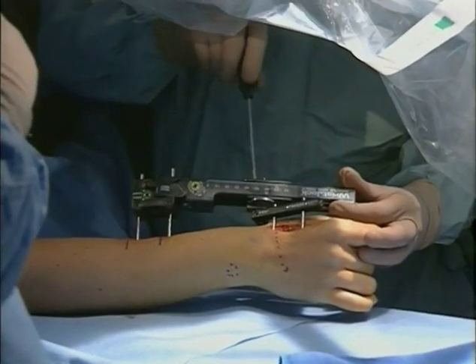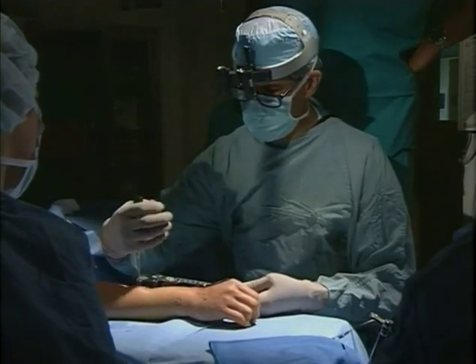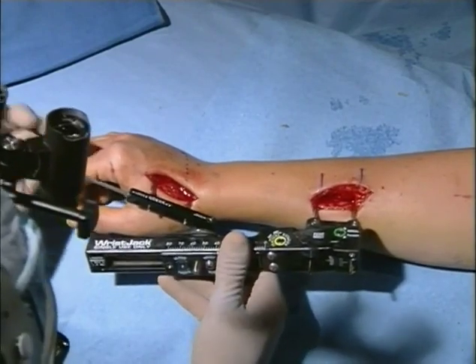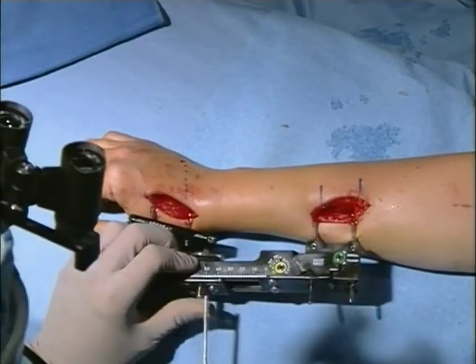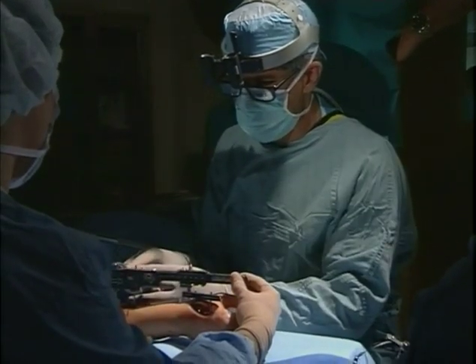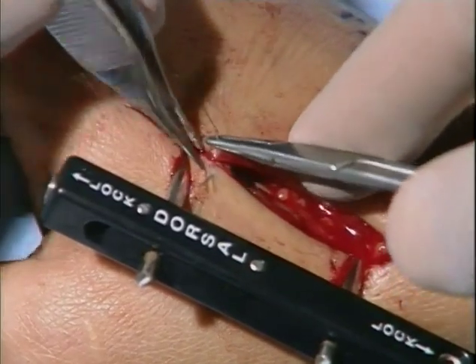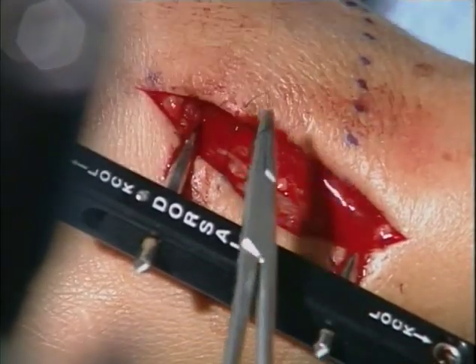We prefer to lock the wrist in a slightly extended position to help maximize the patient's ability to move the fingers during fracture healing. We'll go over the device to make sure everything's tight — tightening the device on the radial shaft pins, on the metacarpal pins, tightening the metacarpal bar to the wrist jack, and making sure the wrist lock is locked. We'll cut the extra length of the radial shaft pins off so the patient won't get caught in a garment. In general, we prefer to use fairly loose sutures — if you close these wounds tightly, you're liable to have problems including excess pressure on the pin tracks.